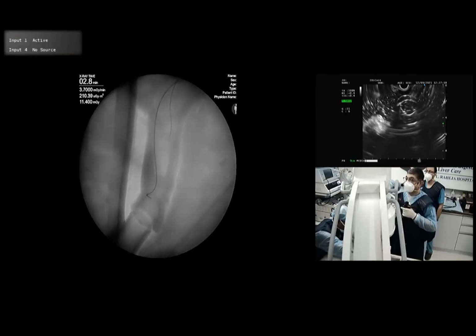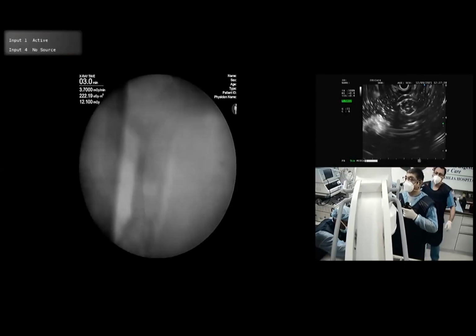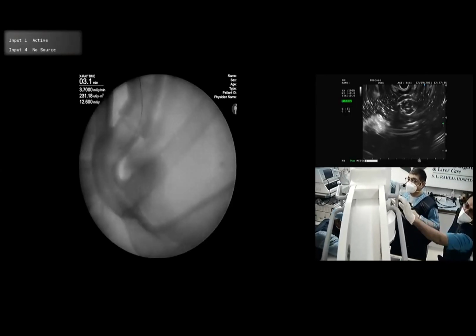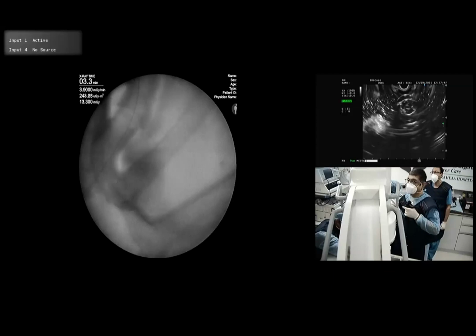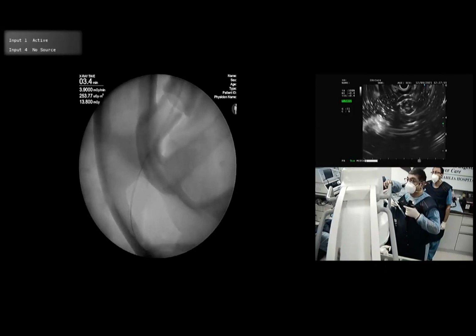So, needle withdraw. Now you are in. Beautiful. See? Go, show below. What are you showing above? See, now you are through the papilla. Show there. Push. Now we are into the papillary complex. Now we are out. You can see. Show the tip. Beautiful. Yes, now we are deep into the duodenum.